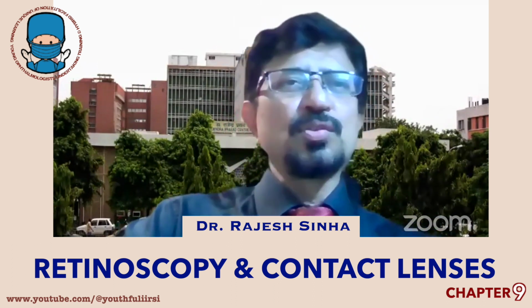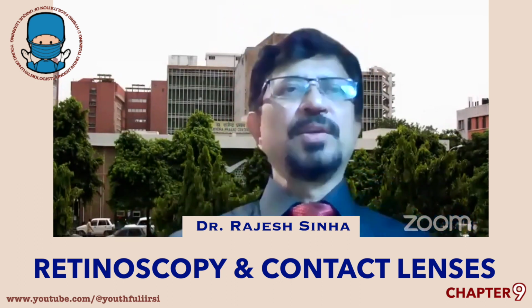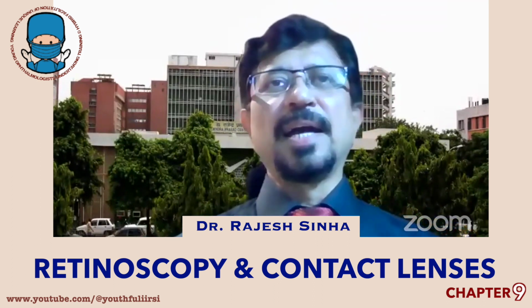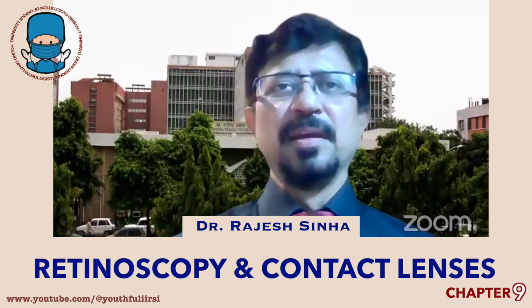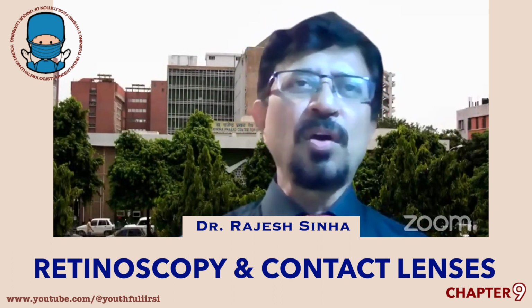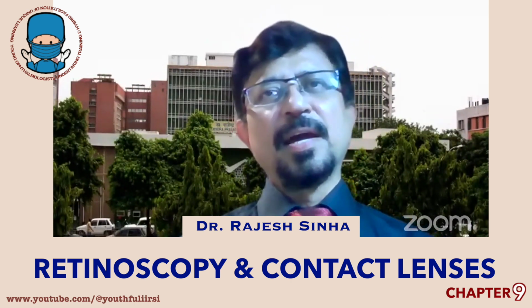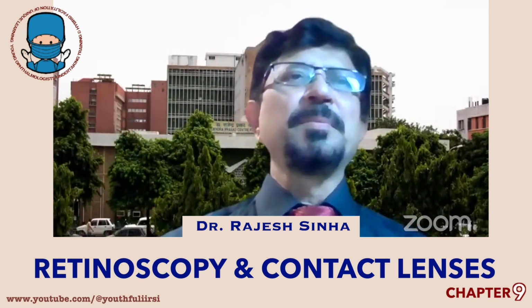So for us, it is for those who do not fall into any of these categories: somebody who is not willing to go for a refractive procedure, or who is not fit for one. That patient will definitely be very happy with orthokeratology. Apart from that, another very important indication is individuals who do not have a stable refractive error, because for any refractive procedure you want stability of refractive error. If the patient does not have a stable refractive error, such a case can be handled very nicely.